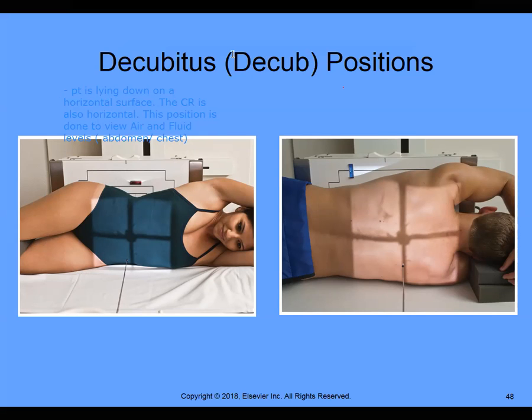In this case, we had said that the X-ray is no longer coming from the top. So in most cases, our X-ray tube would be right here, right? We have our knobs and so forth, and the X-ray would be shooting this way. That's not what we're saying here. What we're saying here is that the X-ray is actually coming in this way. And some X-ray tubes are allowed, we can move them all over the place. So this is our X-ray tube here, and again, I'm just sort of exaggerating here.